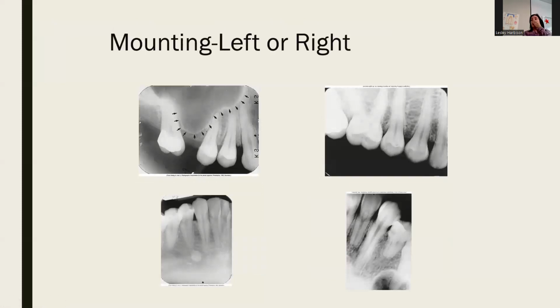And then for this one, what do we have here that stands out at us? The sinus, yeah. And then what about this one? What's going on there? Yeah, good job. What about this one here? Mandibular, yeah. And so this one's what? Upside down? Good. You guys are so good. Okay, let's see what else we have.